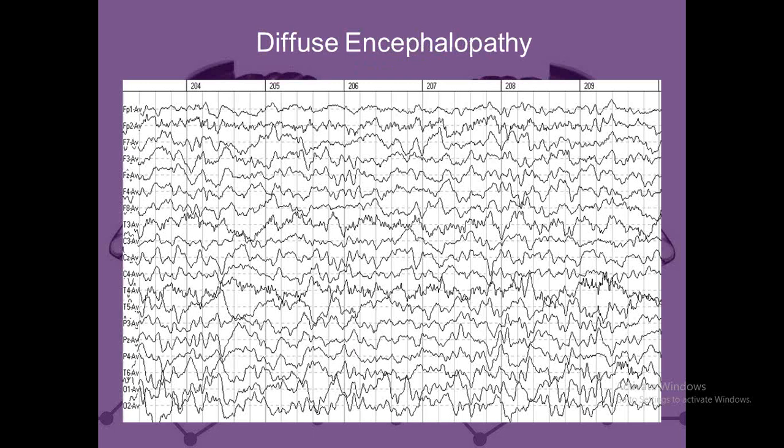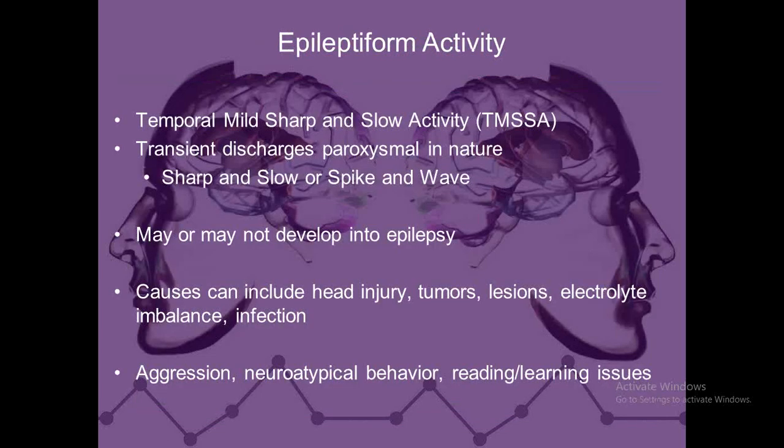Okay, and this is what it looks like. So it's very unremarkable on the EEG, especially if you can't see what the microvoltage is coming out of this, and it's something that can be used in the future to develop some sort of concept. But again, the electroencephalographer is the only one that can call a low voltage slow EEG, or call it encephalopathy as a diagnosis.